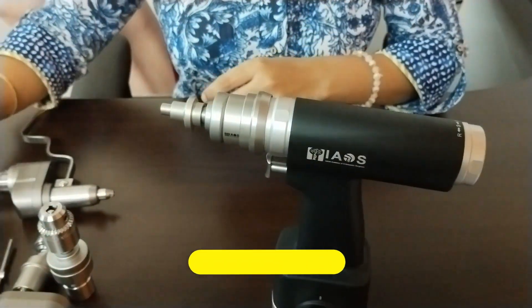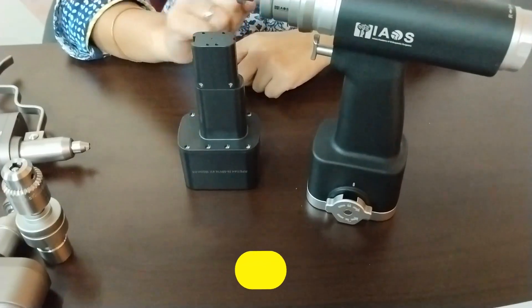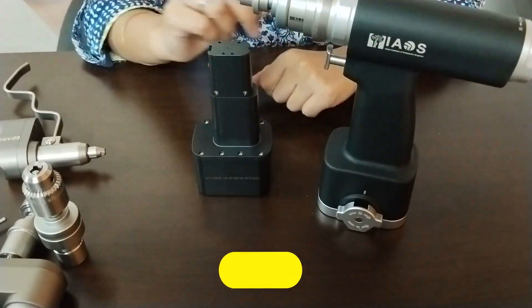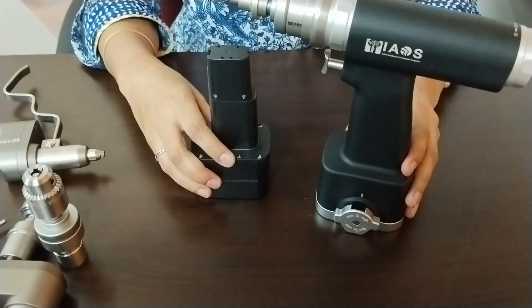Along with these, we have the chuck keys. The long T-handle provides improved ergonomics. We have two batteries — one is in the handpiece and one is separate. The batteries are 1800 mAh. Please be careful: do not autoclave the battery. Batteries are not autoclavable.